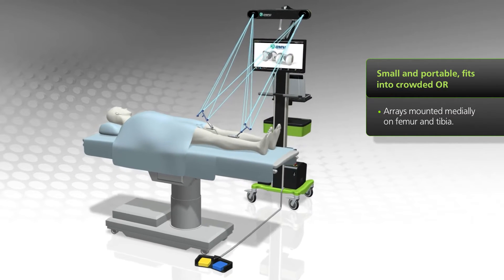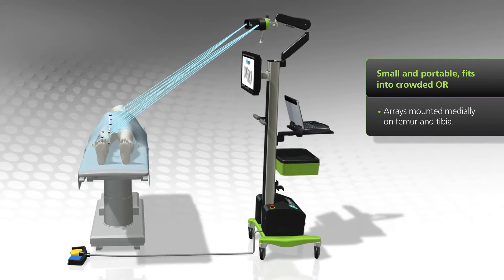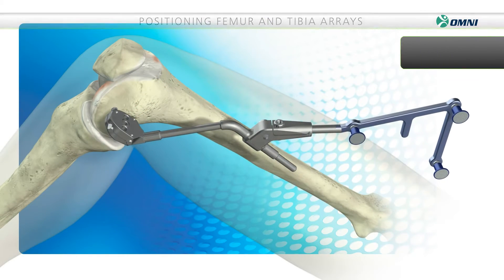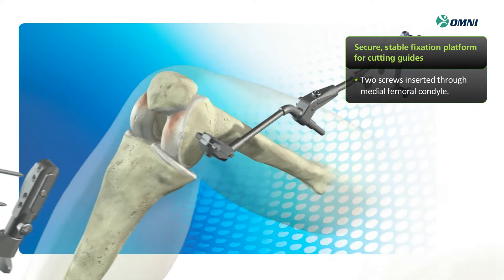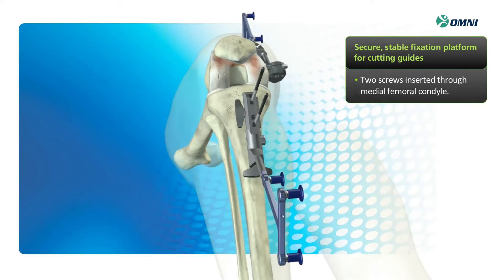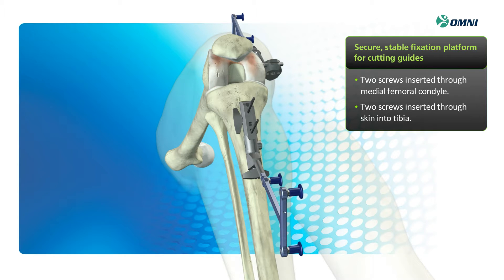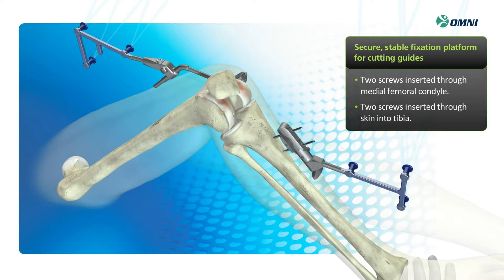Arrays facing the camera are mounted medially on the patient's femur and tibia. Setup for the robotic cutting guide begins by mounting the femoral arrays with two screws inserted into the medial femoral condyle using the pin placement guide. The tibia array is then attached with two screws inserted through the skin. The arrays are placed on screw fixations and calibrated to sync with the camera, creating a secure and stable fixation platform for the robotic cutting guide.